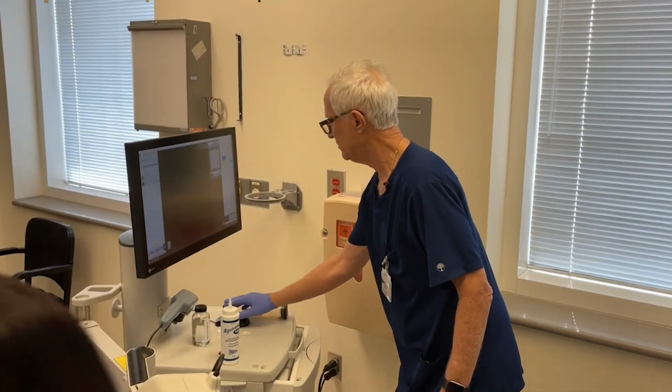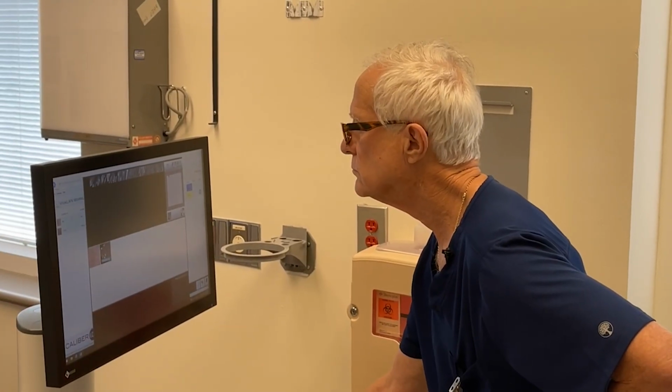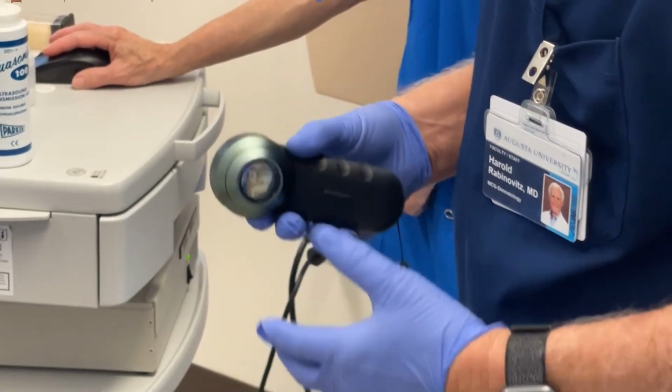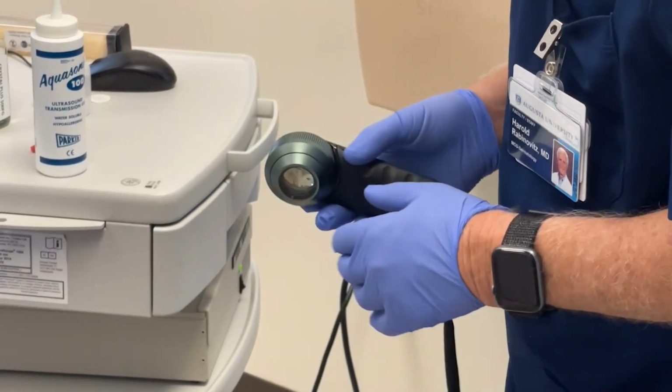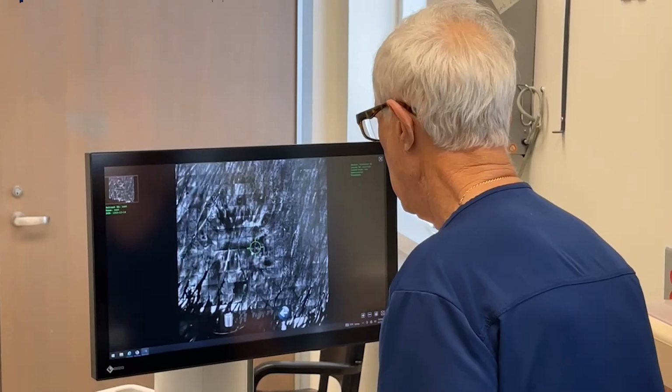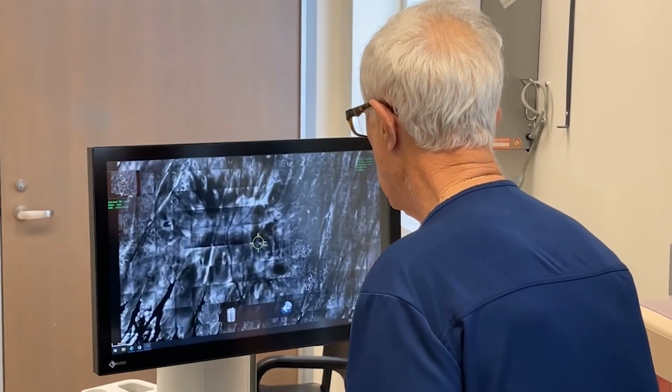And then Dr. Rabinovitz came in and he did a thorough investigation of my whole body. In the past, we've used our eye, and our accuracy is about 60% with our eye in terms of distinguishing an atypical mole from a melanoma. We use a little handheld device which is called a dermatoscope. When you put alcohol on the skin, it makes the outer layer of skin clear, so you can see patterns that you can't see with your eye. And it increases our ability to diagnose a skin cancer of a melanocytic derived neoplasm from 60% to almost 80%.